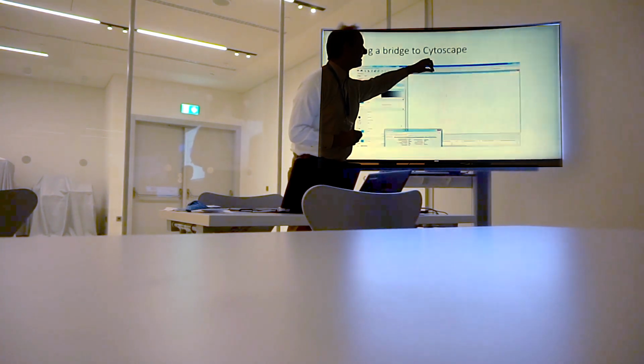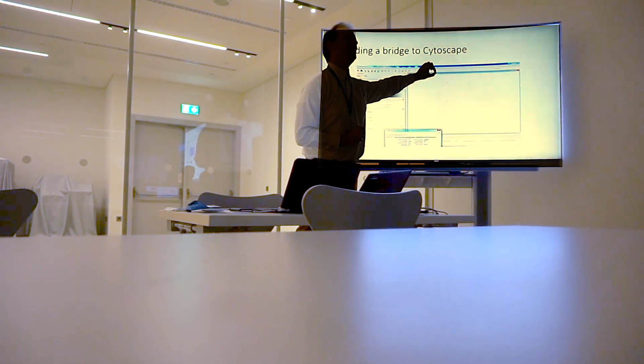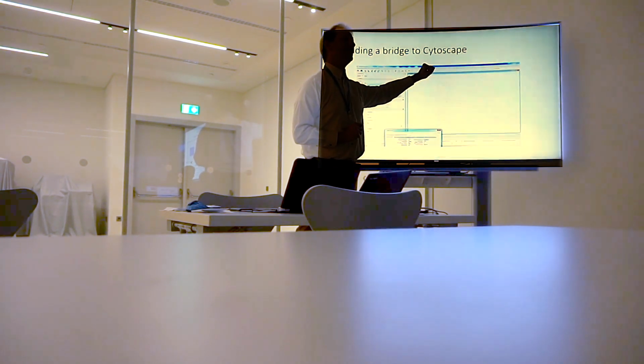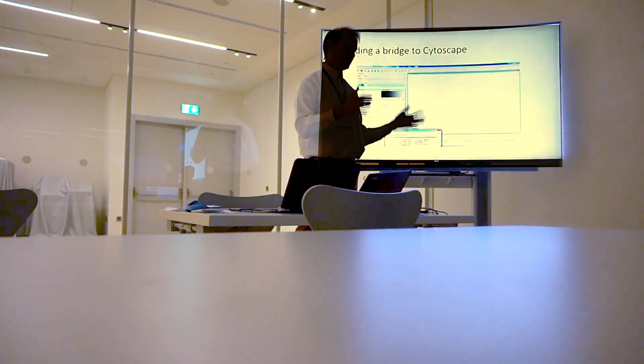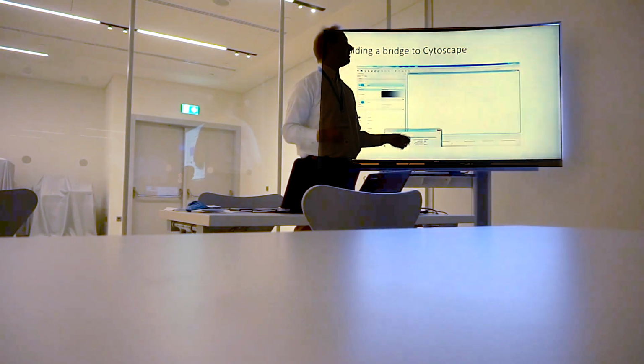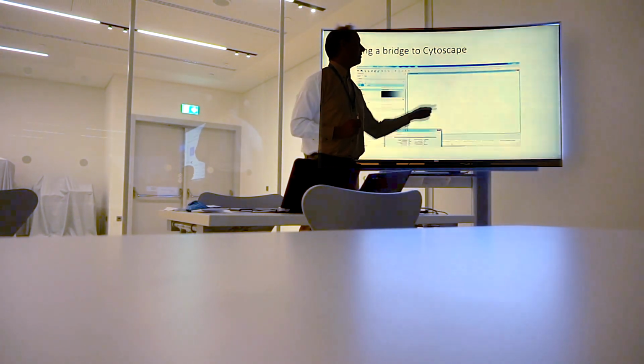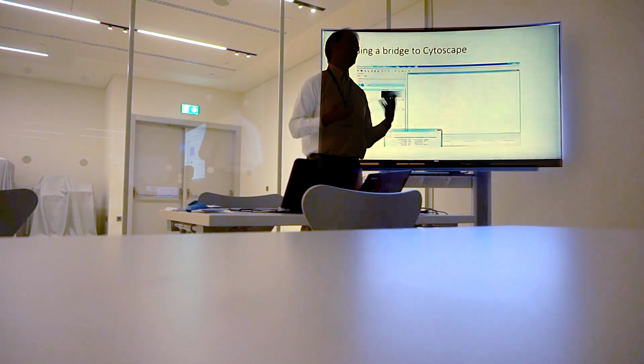But yeah, so one of the things you can do now with the plugin is say that if they're really close together, don't bother defining the edge. And you can kind of define a sweet spot. Like if they're too far from each other, don't bother. Like, don't connect this cell with this cell, but only connect the cells if they're within a certain radius.